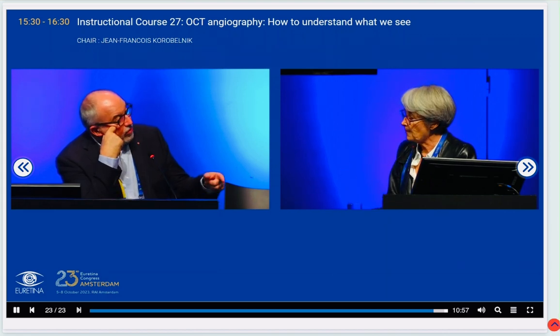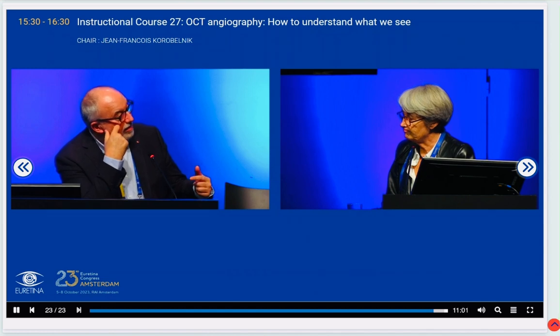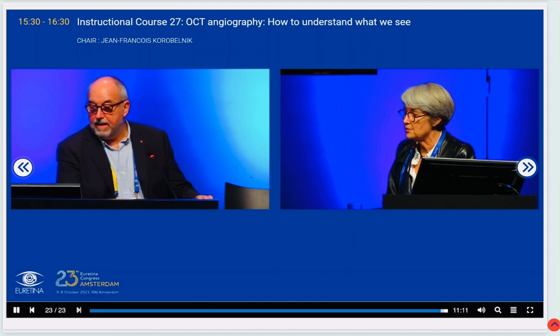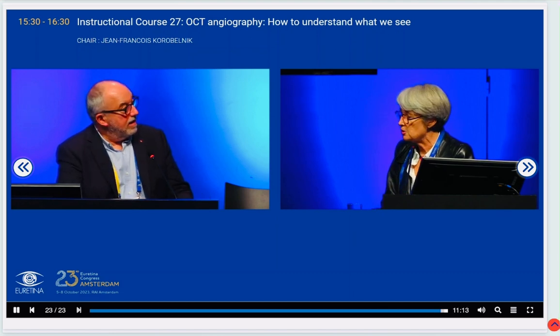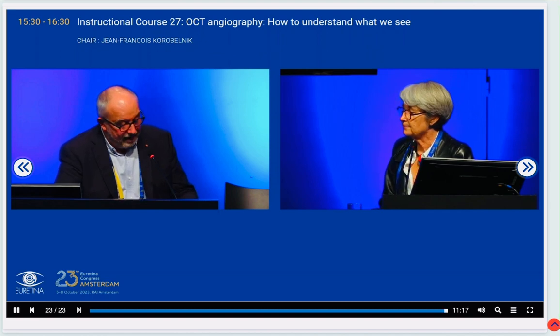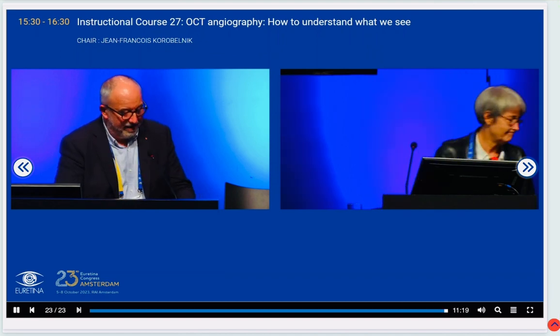But if you have a small hemorrhage, then it is a CNV, and then you can treat without ICG or without FA, or you still want to do it to do everything? To confirm, you mean? To confirm, yeah. If I see the new vessel on the OCT angiography, I don't need ICG angiography. Not at all. It's enough for me. All right. Okay, thank you very much again.